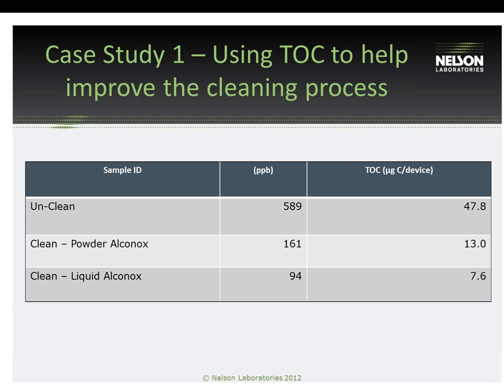And with that comparison to the unclean, you can see that drop there with both of the numbers from the 589 part per billion down. You can see that this cleaning process is actually doing a pretty good job of removing residues from the device.